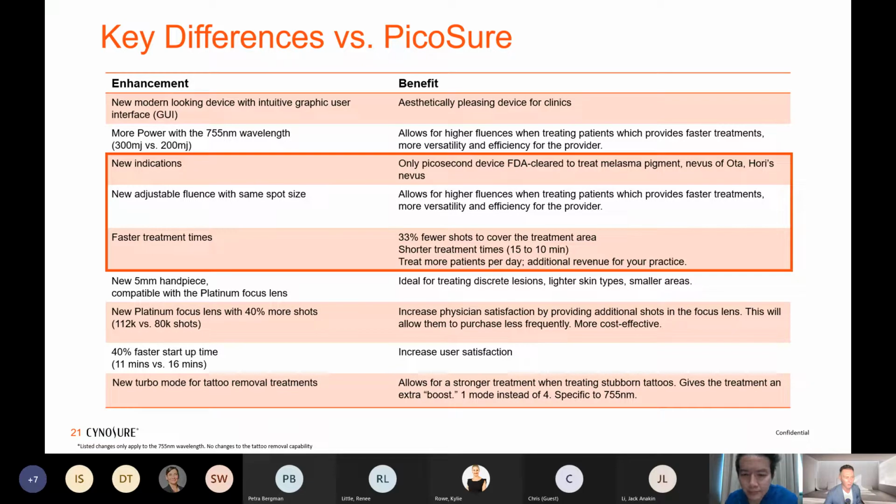And what if you had a mixed patient base, with a lot of fair-skinned Caucasian types and Westerners? Yeah, I agree. I also have a small percentage of Caucasian skin patients, and what I found was that for them, I tune up the setting very high, and they really love it. They come in every month and ask for it. They say, Dr. Wong, please whack me with the strongest setting of your Picosure, and then my skin looks very nice. Initially I didn't treat many of them, so I was cautious, but I threw caution to the wind for one patient, and she loved it.